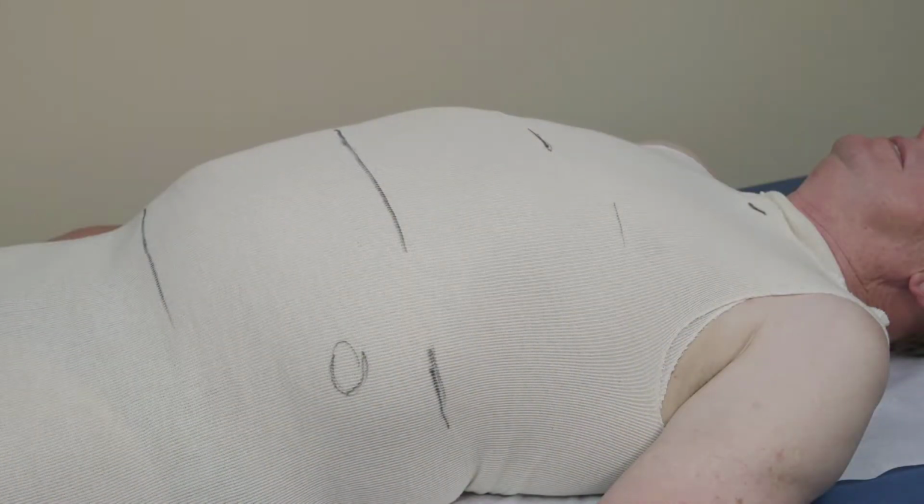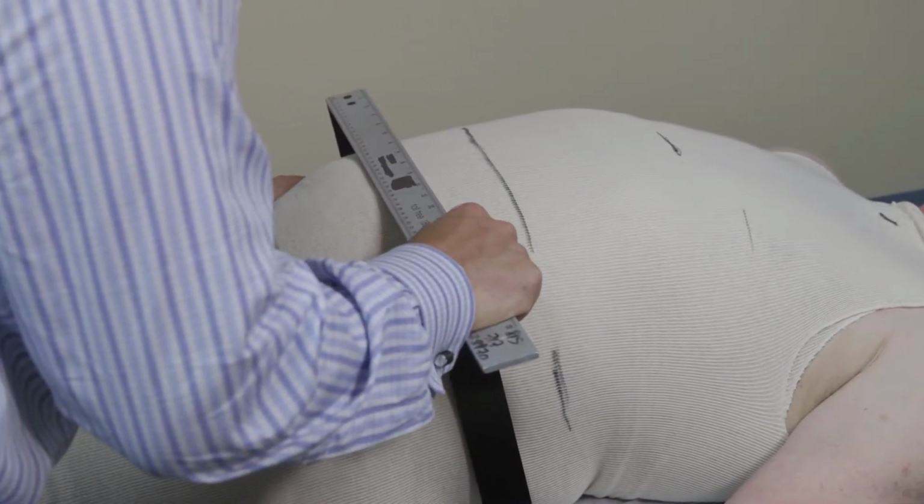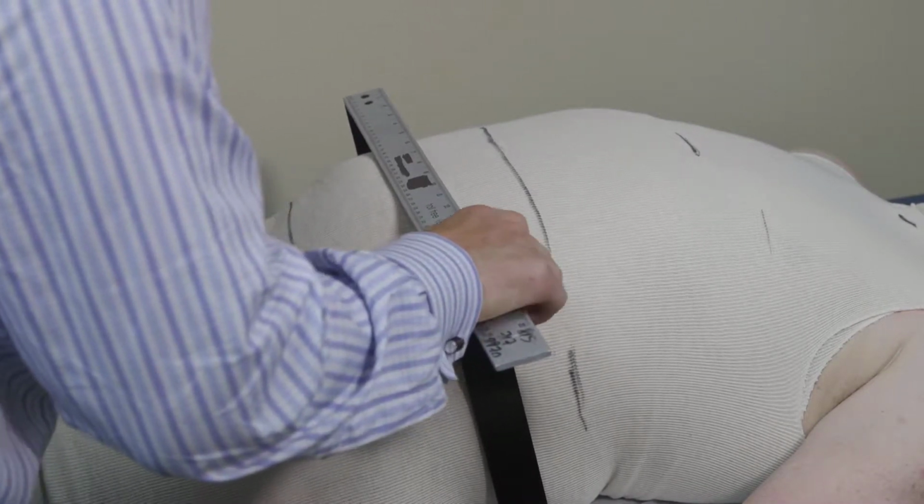Okay, I'm going to grab our ML gauge. The ASIS ML is 15.5.